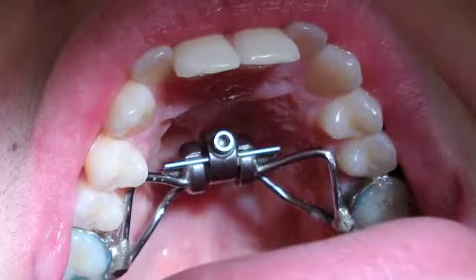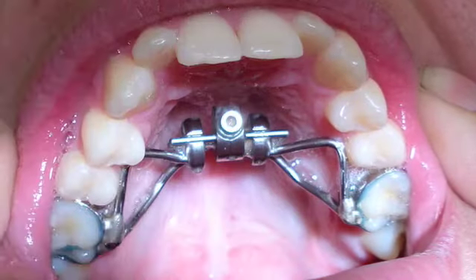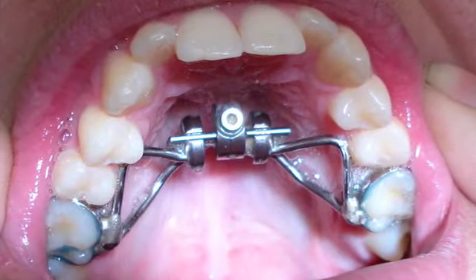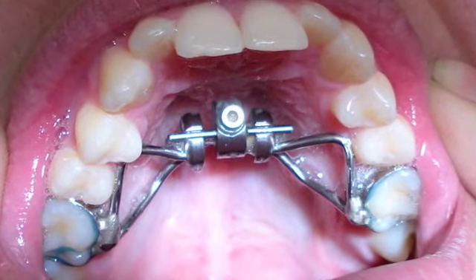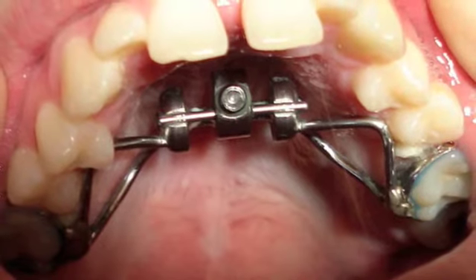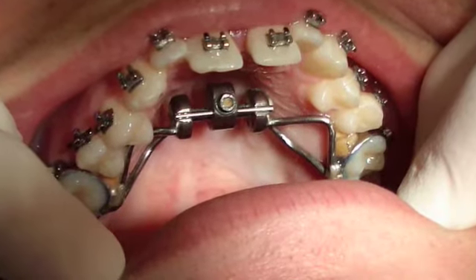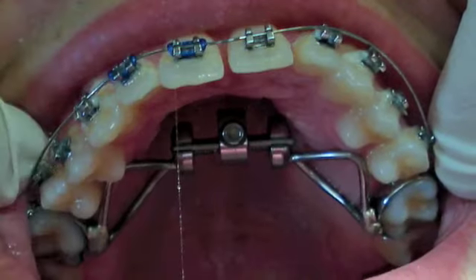The expansion of the palate should be completed after several weeks or possibly longer. Your orthodontist will monitor the expansion process on a regular basis and instruct you when to stop the activations. The expander will stay in your mouth for an additional amount of time in order to stabilize the newly formed upper jaw.